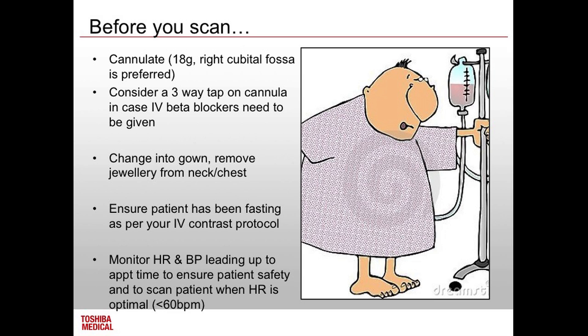And so you sit there and you wait for 5 minutes and then you go, oh no, we'll give another 5. Comes down a little bit, not there. And then you think to yourself, I wonder if that first 5's worn off yet. And now I'm just injecting another 5 mil on top of that, but that first 5 mils is gone. So I find it a bit tricky.